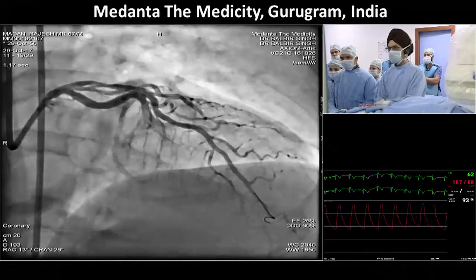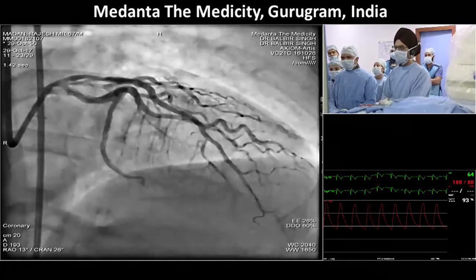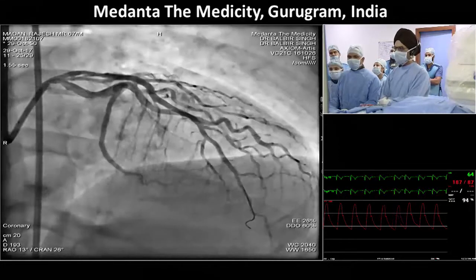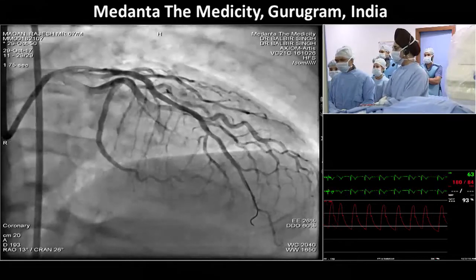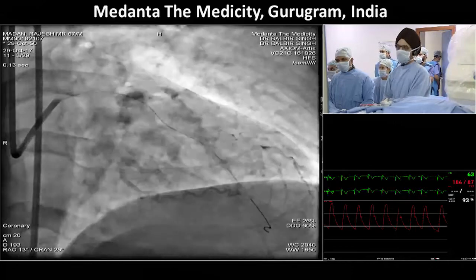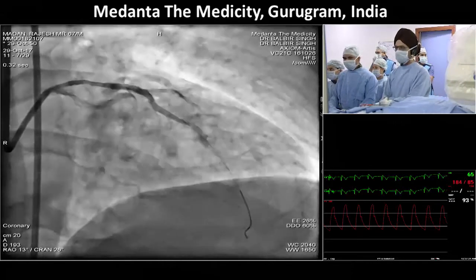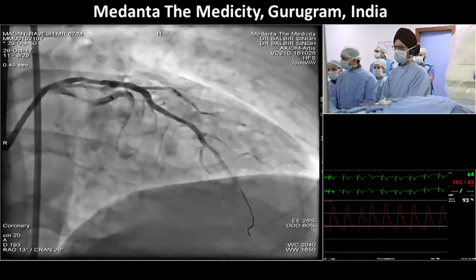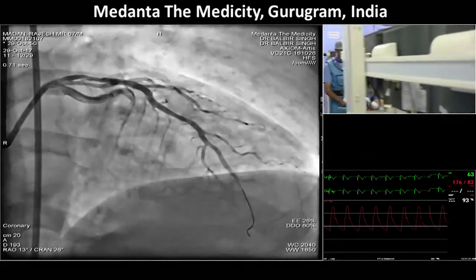So as we said, there is a huge disparity between the size of these vessels, LAD and left main. So without imaging, this would be a futile exercise. So we chose to do OCT. And Vijay is here with me. He's one of our experts on IVUS and OCT. So we've taken a pullback from the LAD and also from the circumflex. So we have OCT, 3D OCT images, and he's going to discuss. Vijay.